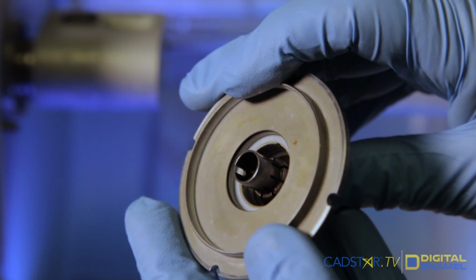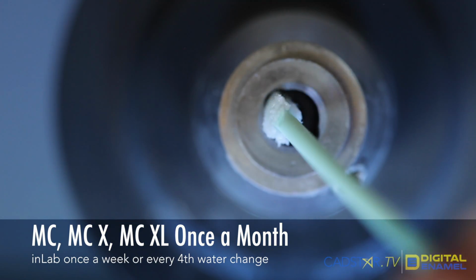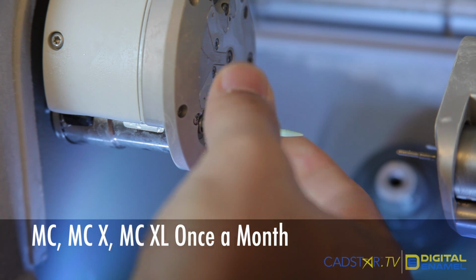Today we're going to talk about some maintenance tasks that Sirona recommends to keep your milling units working perfectly. Sirona recommends that you perform a couple of simple maintenance tasks at least once every month for the regular MCXL user. For in-lab users, it's once a week or every fourth water change.